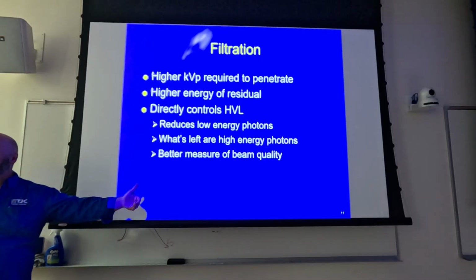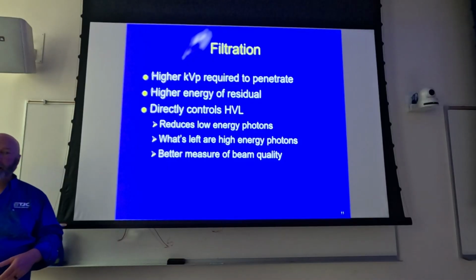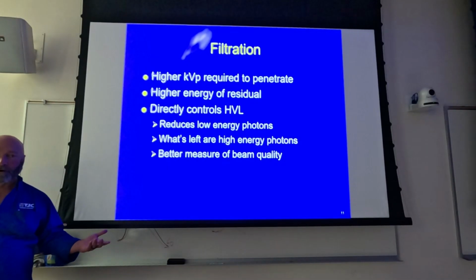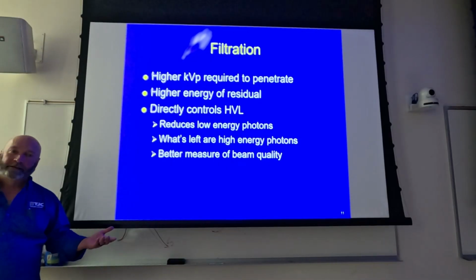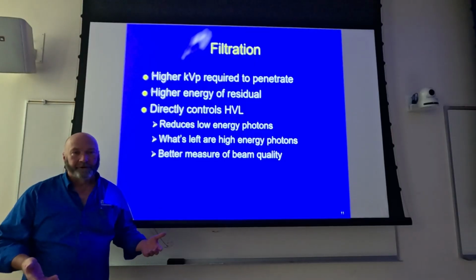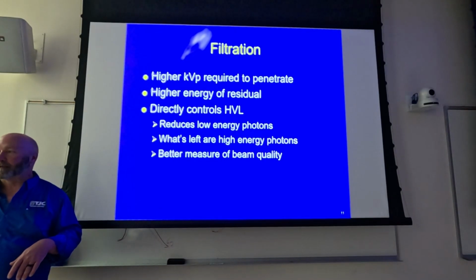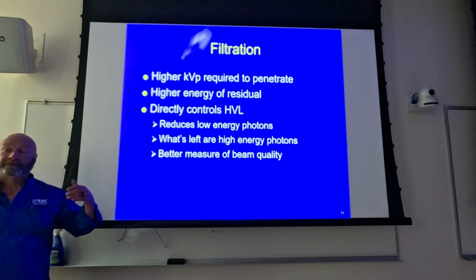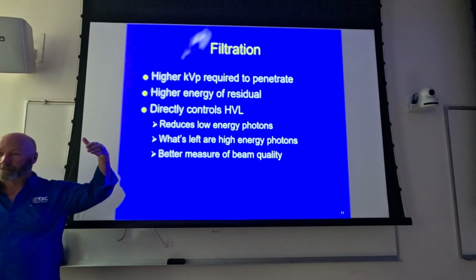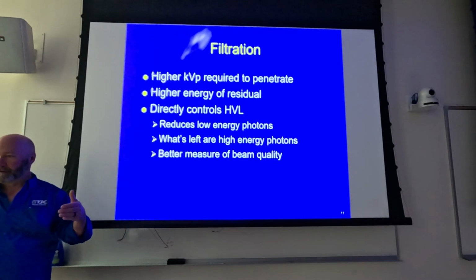So every year they have to come in and do that. They measure what they call an mR to mAs output test, measuring how many mR am I getting for the amount of mAs that the machine says I should be getting. They do that every year, and every year they have to adjust it a little bit, so that now a 6, 7, 8-year-old X-ray tube has a very high quality X-ray beam compared to that brand new tube, but it's still giving you the same number of photons, okay?